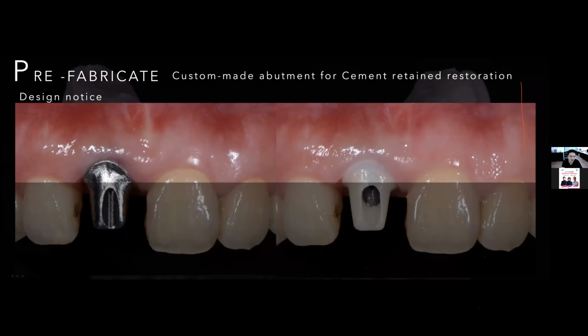It's like the neutral abutment looks like metal porcelain that is very black and dirty. So almost all patients don't like that. So if possible, if you want to create a custom abutment, I think the nice choice is a zirconia abutment. You see, this is the black shadow.